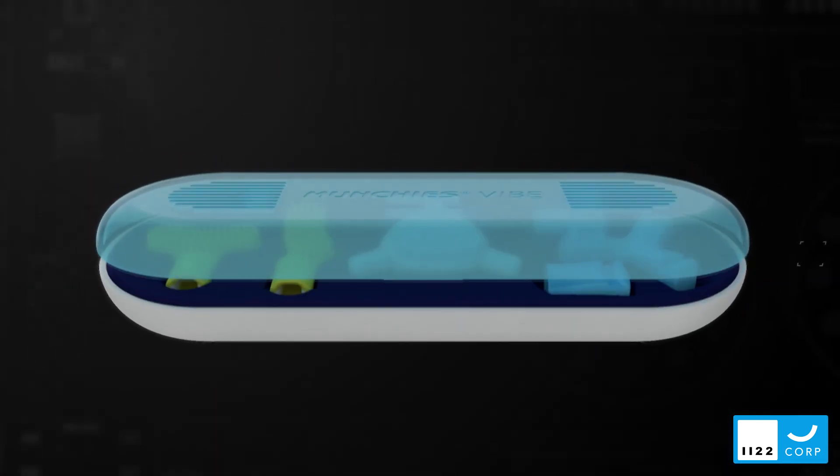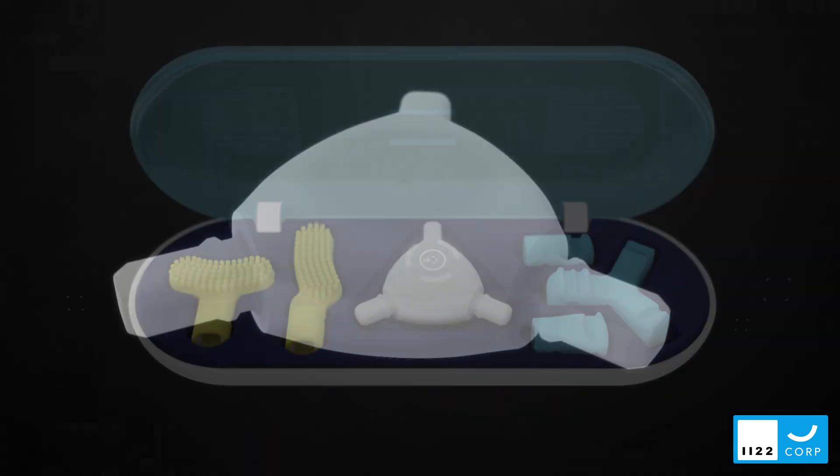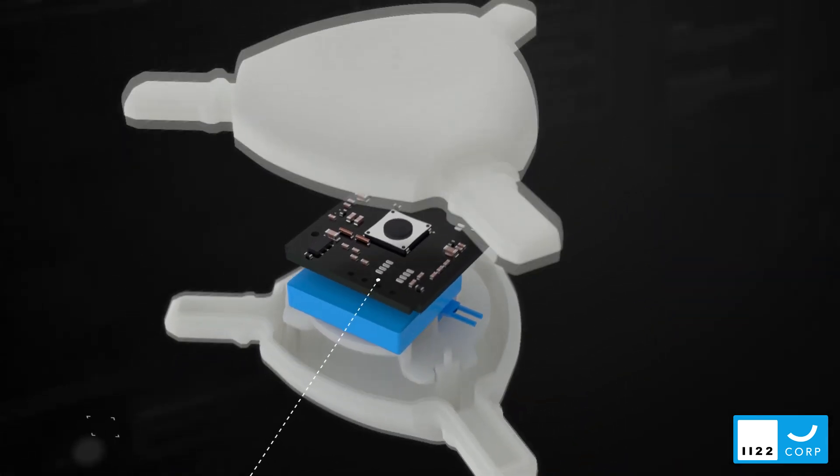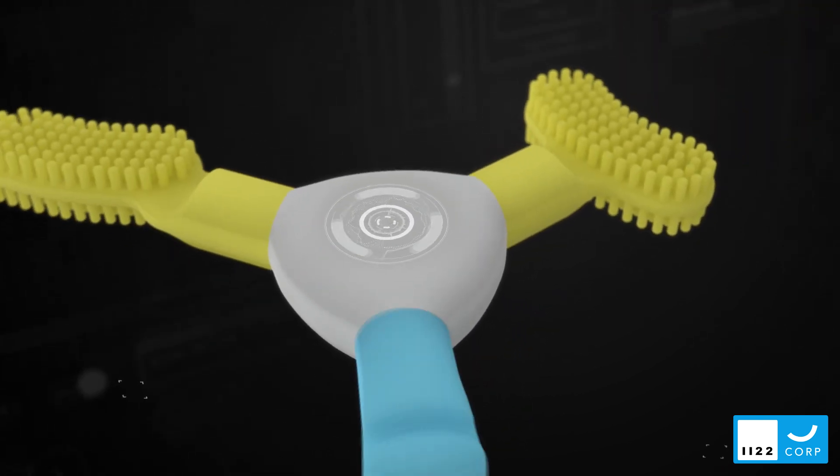Munchies Vibe delivers controlled, symmetrical acceleration through osteoclastic activation and optimized aligner seating, which leads to faster and more predictable orthodontic movements.